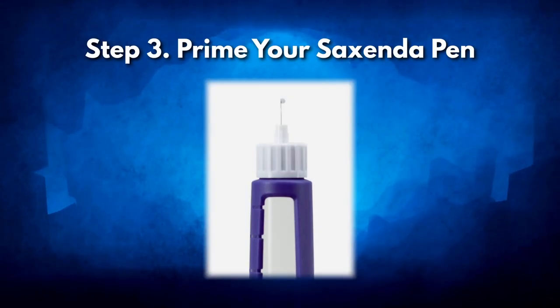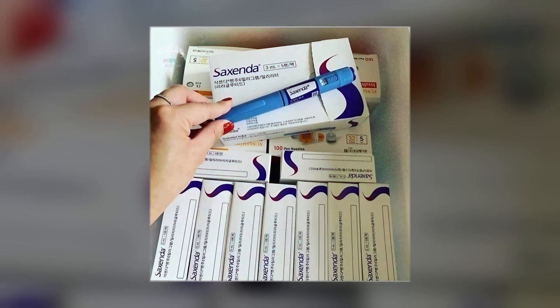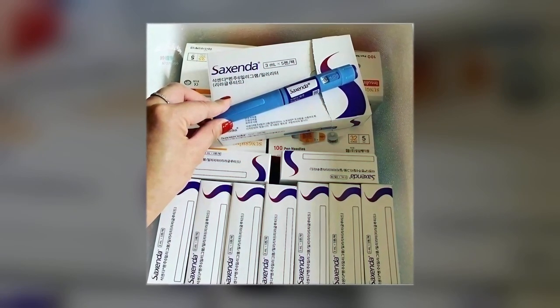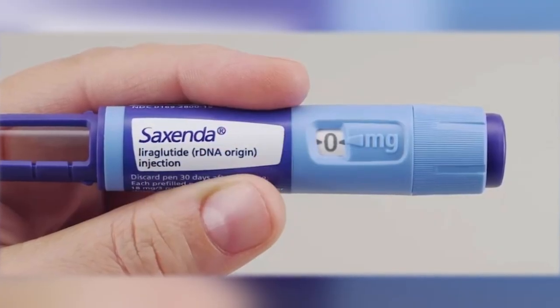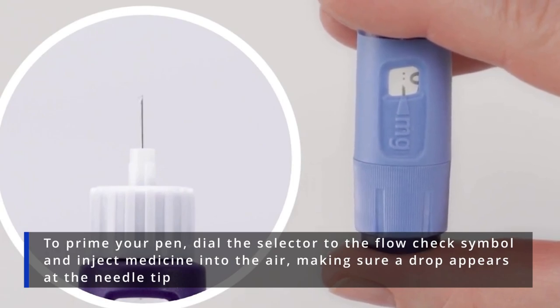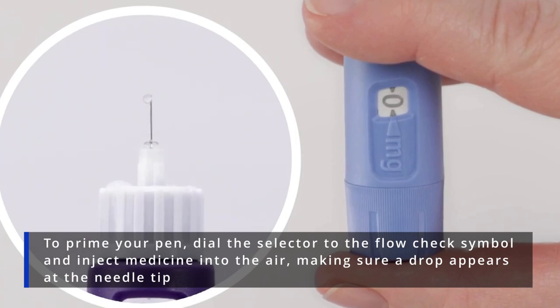Step 3: Prime your Saxenda pen. Priming your injector pen is a critical step, especially if it's a new pen or hasn't been used in a while. This process ensures the pen is ready for an accurate dose. To prime your pen, dial the selector to the flow check symbol and inject medicine into the air, making sure a drop appears at the needle tip.